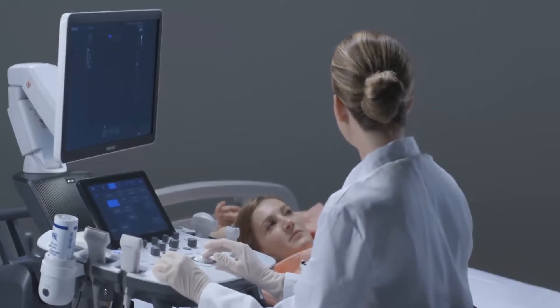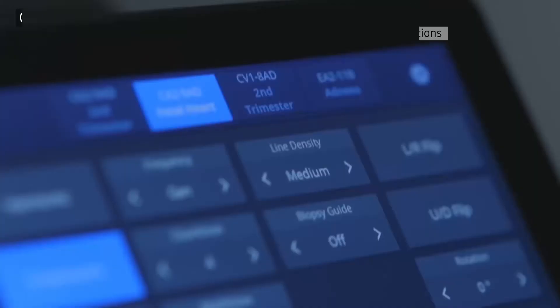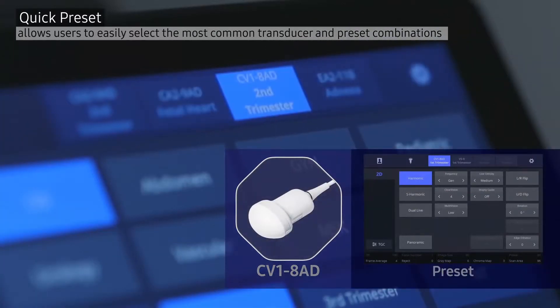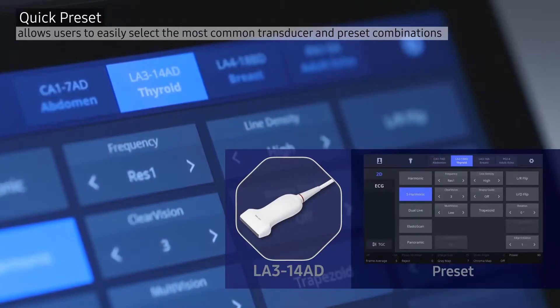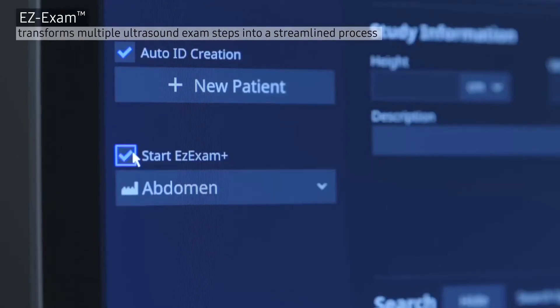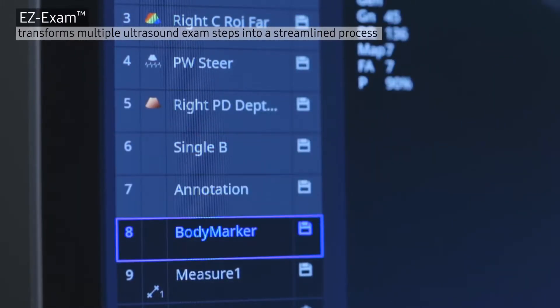HS60 is easy to use and efficient — an ideal solution for handling a higher number of patients with user-oriented features including Quick Presets, allowing users to easily select the most common transducer and preset combinations, and Easy Exam, transforming multiple ultrasound examination steps into a streamlined process.